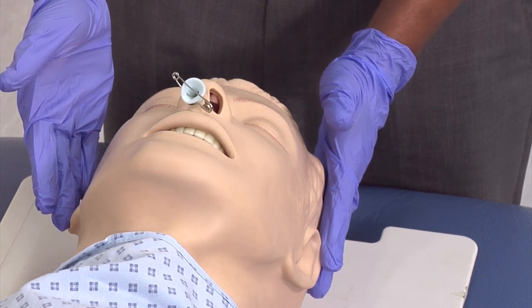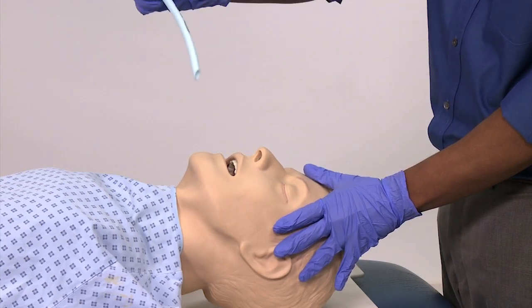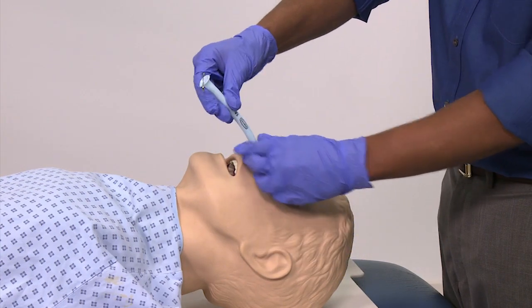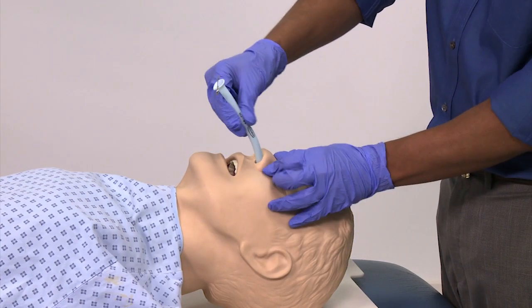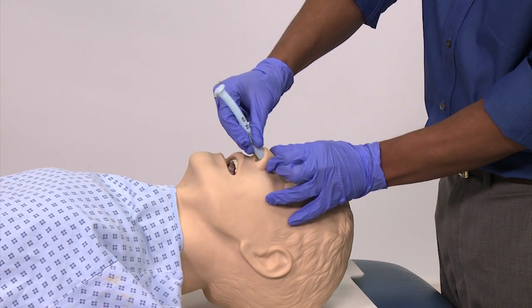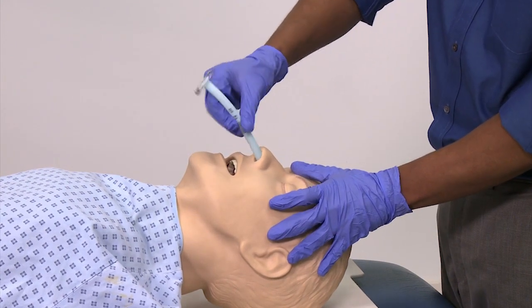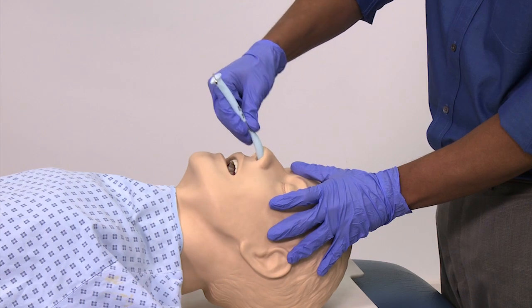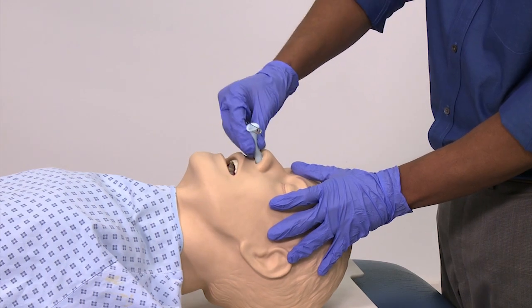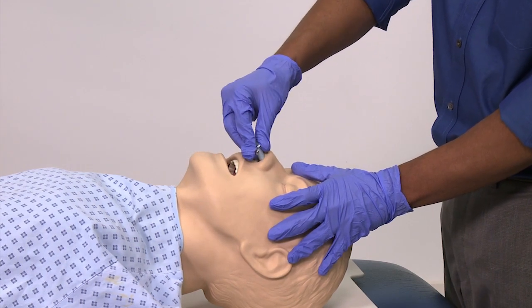If there is too much resistance, pull out and try the other nostril. Once in place, the flange will stop inhalation, but tape may be used to secure it. Both nostrils can have a nasopharyngeal airway inserted to further increase the patency of the airway.